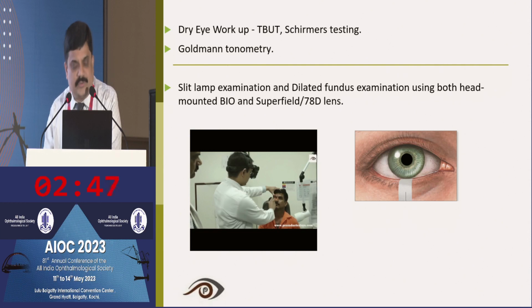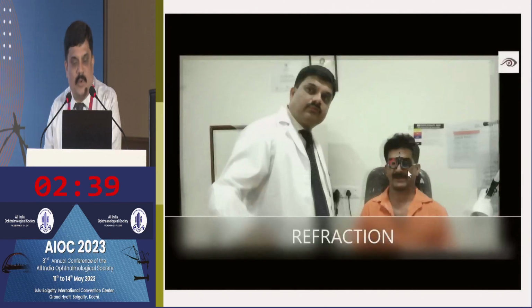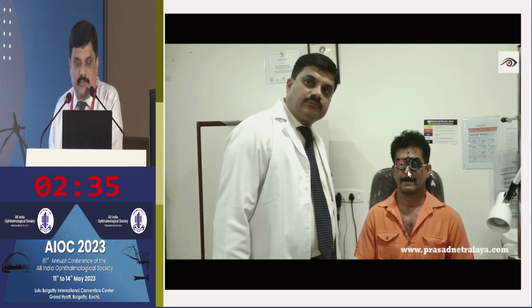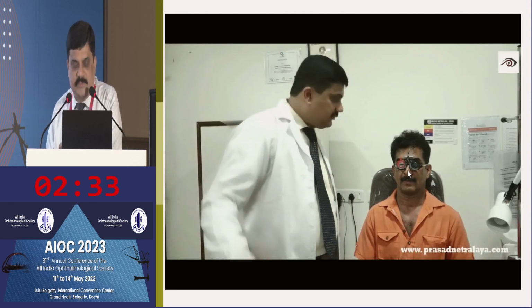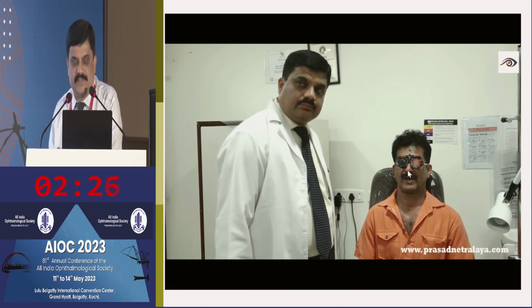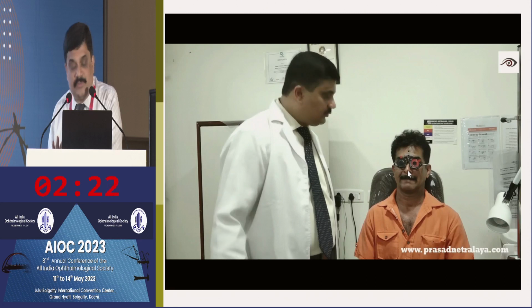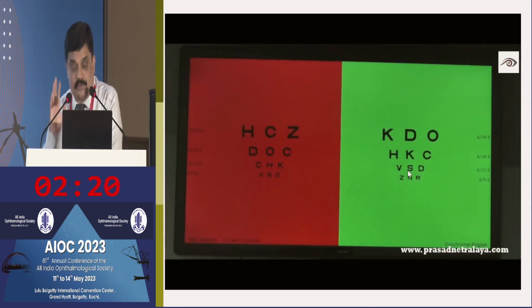Of course, for all refractive patients, you have to do proper indirect ophthalmoscopy to make sure that the retina is also normal, and a proper dry eye workup is mandatory. Even though a lot of optometrists work with me, this particular test I do myself: both eyes are checked for distance vision. Once I am through with the distance vision, I always make sure that it is duochrome balanced. And for most refractions, even with myopia, I do cycloplegic refraction.